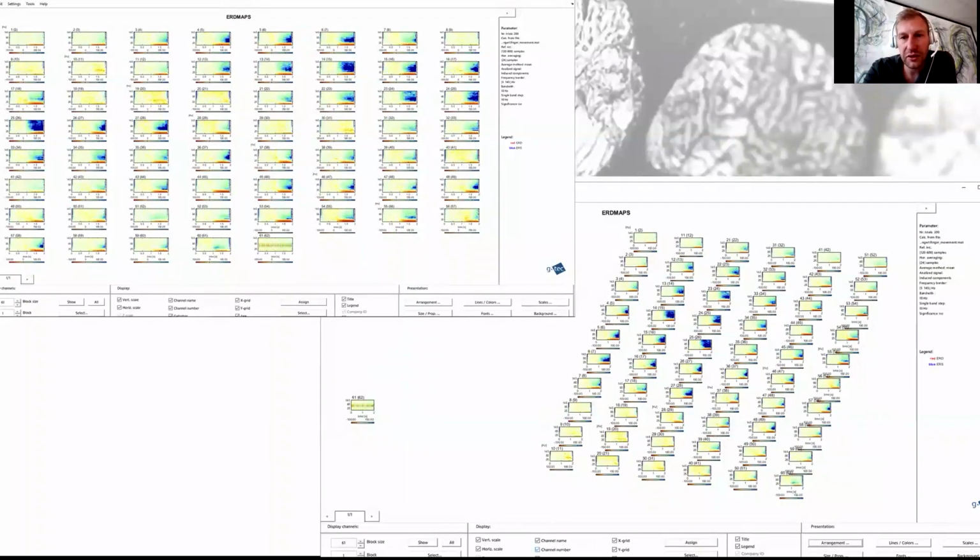On the bottom right, you can see that the grid shape is also taken into account. We can now understand that there are actually some regions of the cortex where we have a grouped activation with a hotspot of basically 5 to 6 electrodes and a bit of minor activation surrounding them.